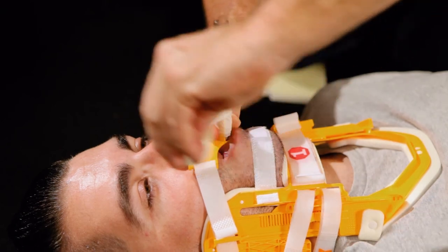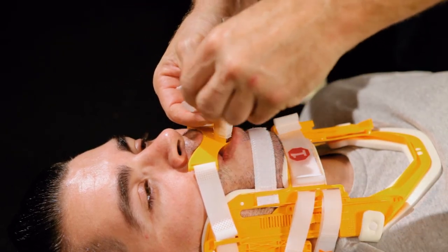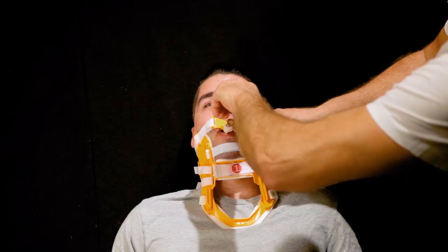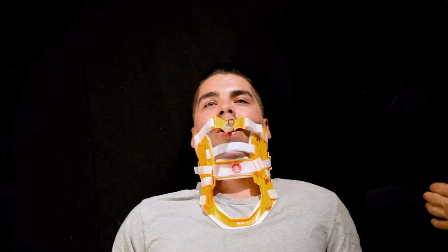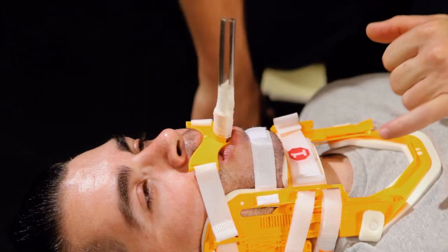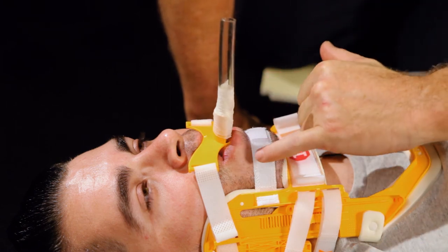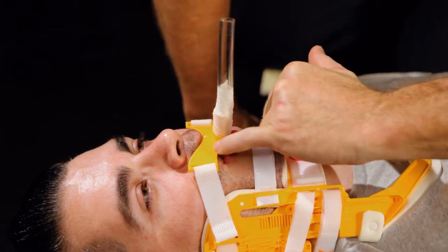The X-collar tube holder secures to the splint and not the patient, avoiding blockage of venous return and optimizing oxygen delivery, thus increasing chances for patient full recovery post-cardiac arrest. The tube holder also leaves access for suctioning on both sides of the patient's mouth.